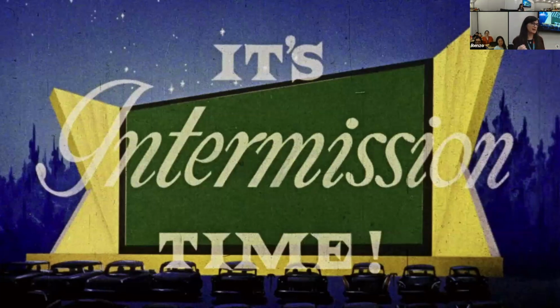Also, I will say that if you use compressed sensing algorithms and you really push undersampling, your images will have artifacts. There's no real way around that. But they look a little bit different, and they're more based on the types of fitting that you're doing. They're not based on the same artifacts that we were talking about here. But I'm happy to talk about that more offline.